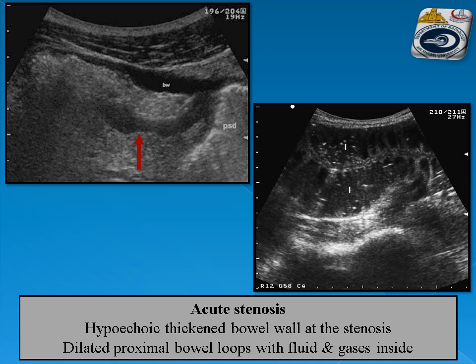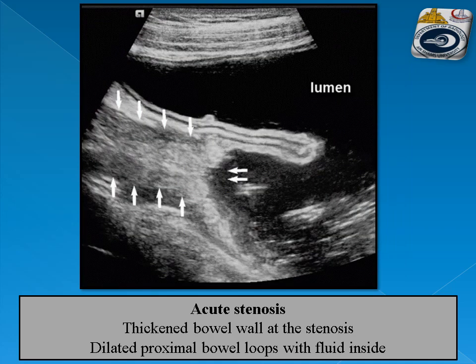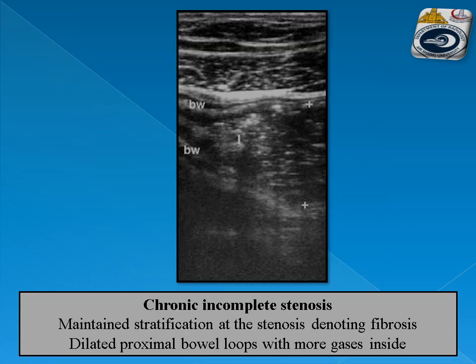In chronic incomplete stenosis, the amount of air within the proximal loop prevails and peristalsis is usually weak. Loss of stratification at the level of the stricture suggests its inflammatory nature with lower degree of fibrosis; however, presence of stratification suggests a higher degree of fibrosis. In this example of chronic stenosis, the structured bowel segment maintains its stratification with air predominating in the proximally dilated bowel loops, indicating higher fibrosis and chronic incomplete stenosis.